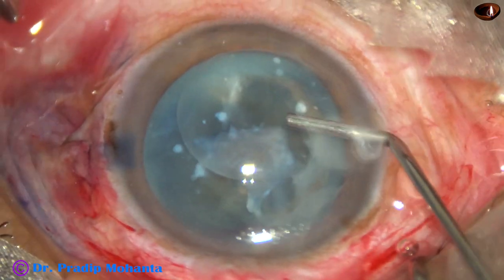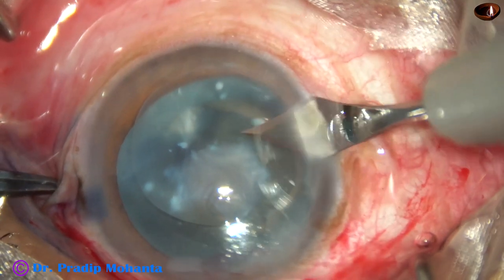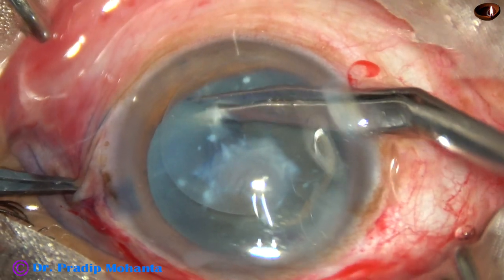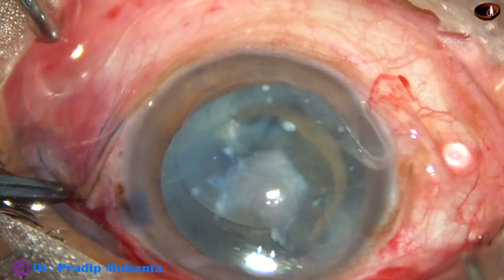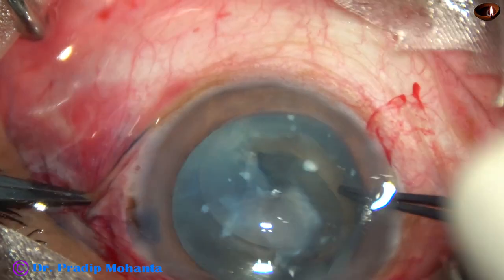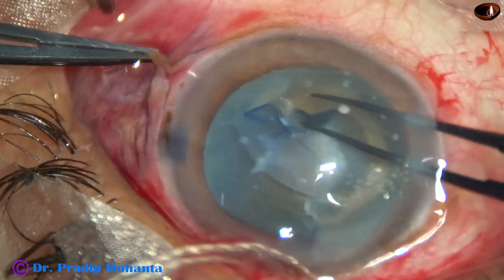Inject some more visco. Now I am going to enlarge the side port at 9 o'clock using the 2.8 mm keratome, because I am going to use the Vannas scissors, and it will require this size of wound. Now I introduce the Vannas scissors and cut the band at its base. And I hope I will be able to do the capsulorhexis now. Let us see. Now I use the Utrata through this side port — because the side port is now enlarged to about 2.8 mm — hold the capsule, and yes, now I can do the capsulorhexis.